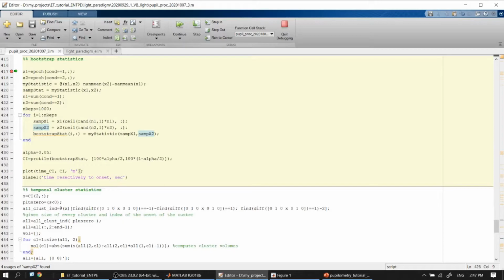After the distribution is formed with a large number of repetitions, you know what is the likelihood of getting an effect size like this randomly generated from the same data with random distribution between two conditions.